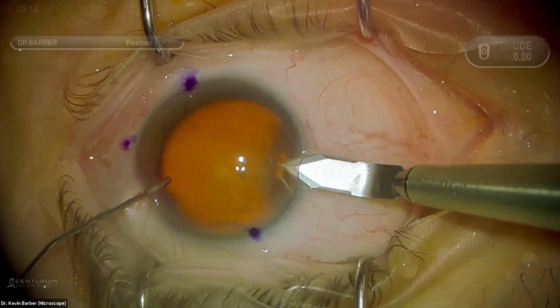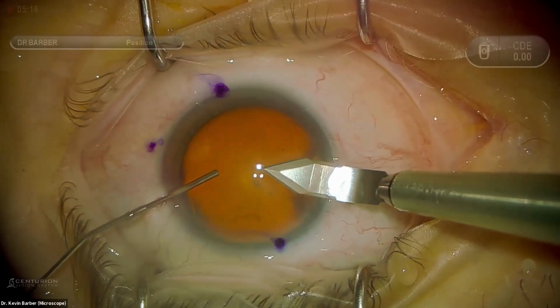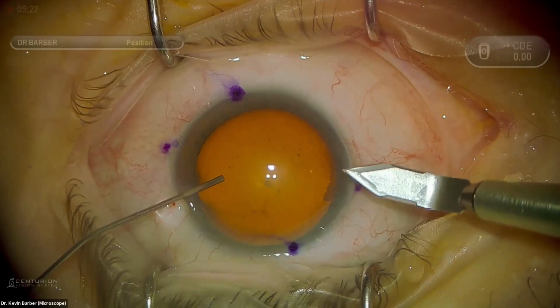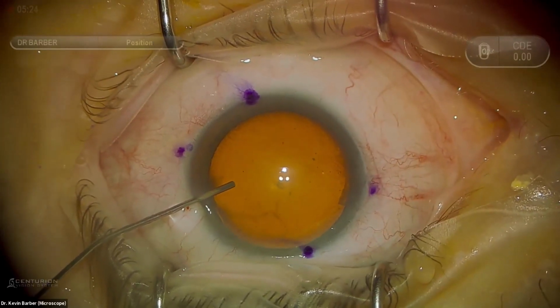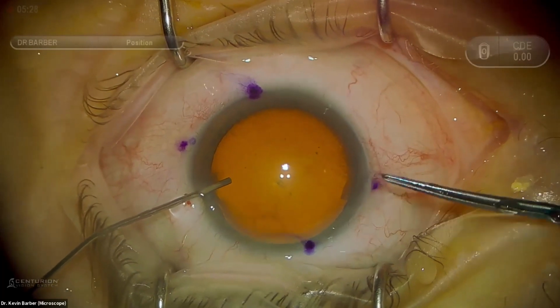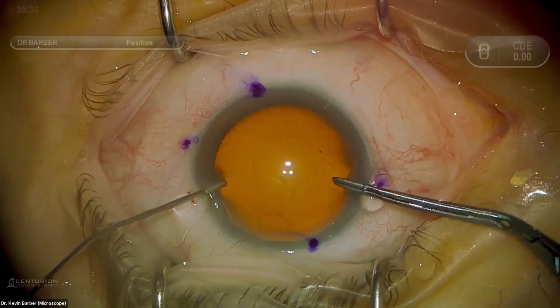Again, clear corneal incision, triplanar, using a 2.4 keratome. You can see the internal lip of the wound. Here's a straight line. That's a sign of a good wound that's going to seal. If it has that chevron incision, that's not going to seal quite as well.